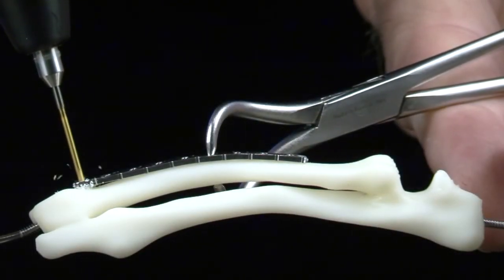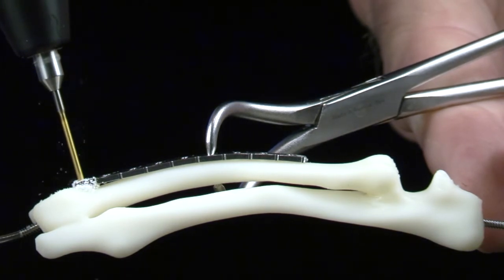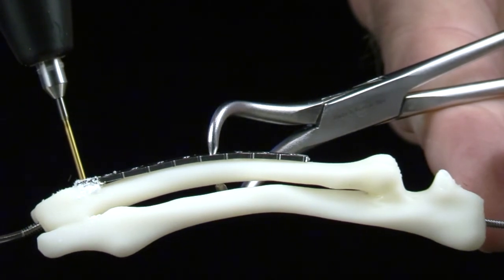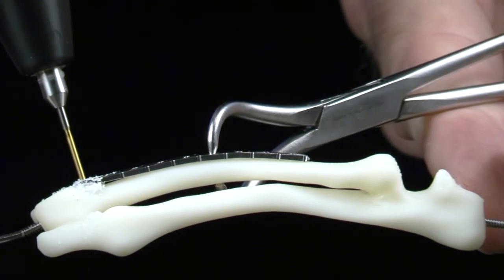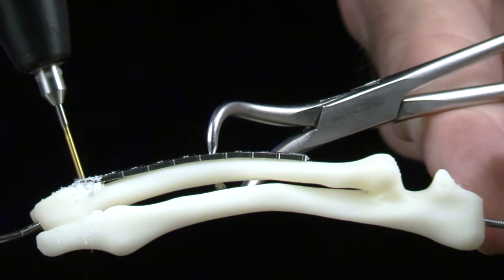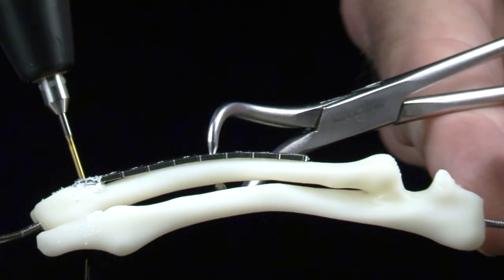After securing the plate into the proper position, pre-drill for the first screw insertion at the selected hole location. It is very important that the drill bit is perpendicular to the plate surface at the plate hole where drilling is occurring. Perform drilling with the pecking technique to avoid bogging or stopping the drill bit.